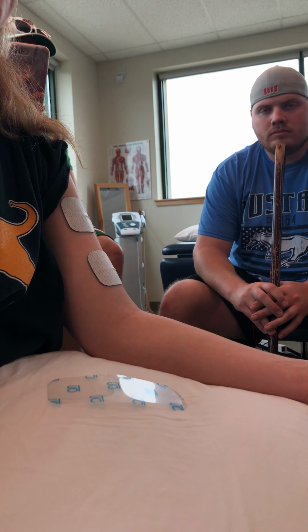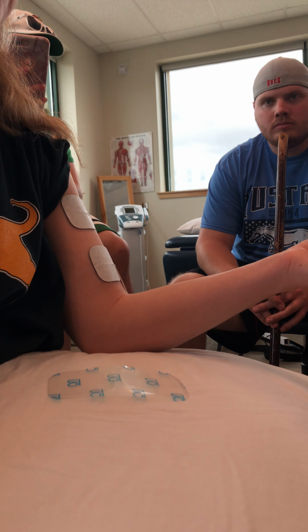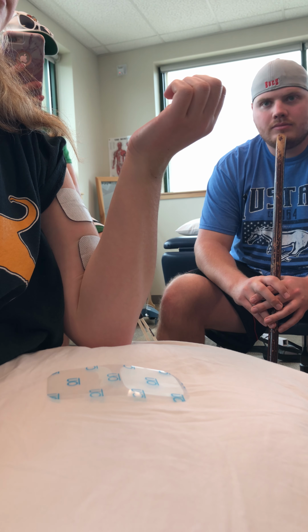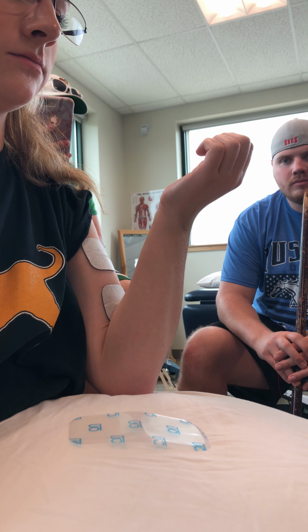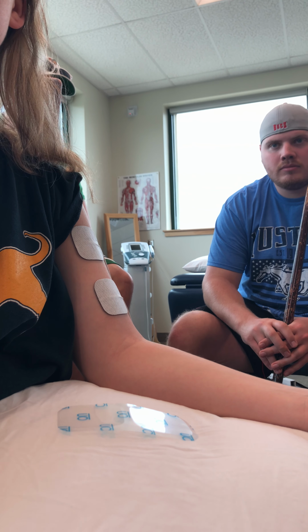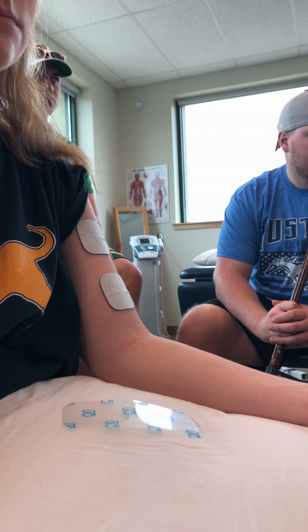All right, so was that okay as far as tolerating that? And as soon as you feel it again, you use your voice as like a stimulation. Okay, pull, pull, pull. All right, keep going, hold, hold, hold. Keep holding. When you feel it shut off, just lower it slowly, and you have to know that you're doing eccentric of the biceps here. All right? So I'm not gonna keep having you do it, but it's that easy. It's just the placement.